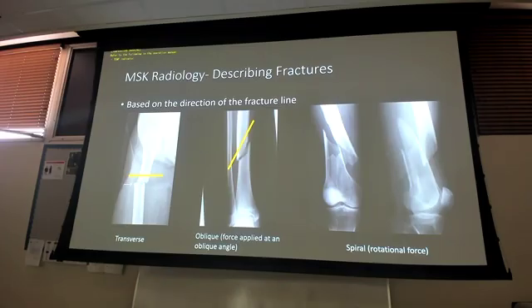How do you differentiate between an anterior and posterior view? You don't have to, because there's no such thing as a posterior hip x-ray. We don't cover what types of views a lot. Ortho will a little bit, because there are special views you can order for ortho stuff. We don't cover a lot of views because when you order a hip x-ray, you just get the pictures, right? You order a shoulder x-ray, you order a knee x-ray, you get the pictures.